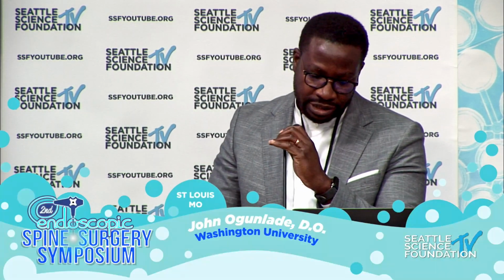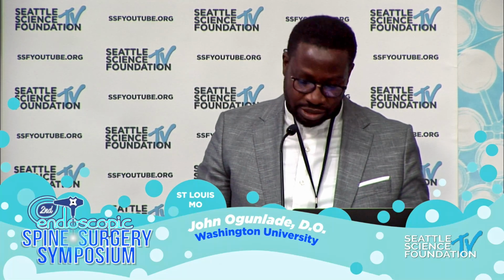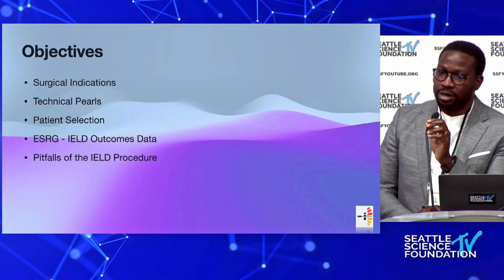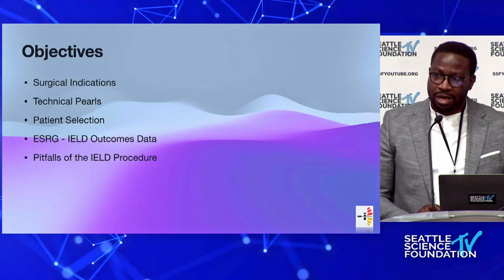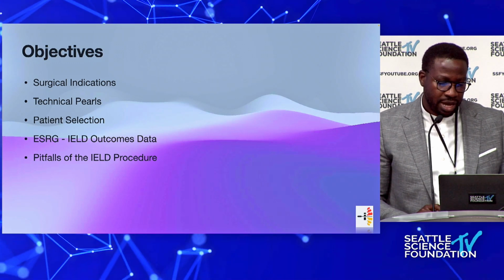All right, so I get the pleasure of talking to you guys today about interlaminar endoscopic lumbar discectomy, and honestly, it's a great technique, and I think it's one that if you learn the technique, it will help translate and improve your ability to do endoscopic laminectomies and even more targeted decompressions and even cervical foraminotomies.